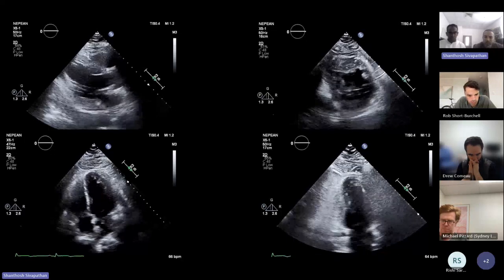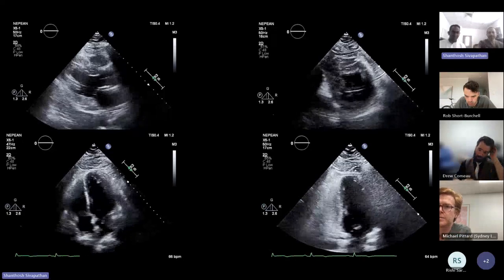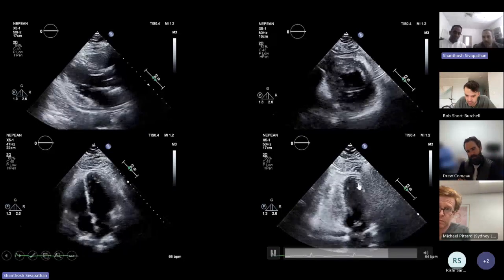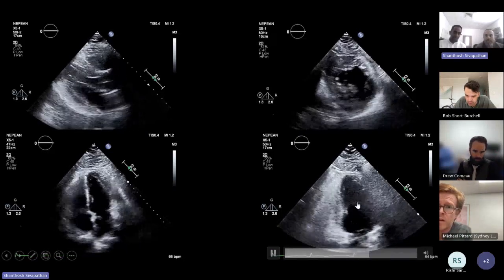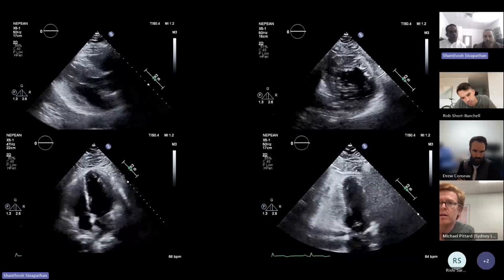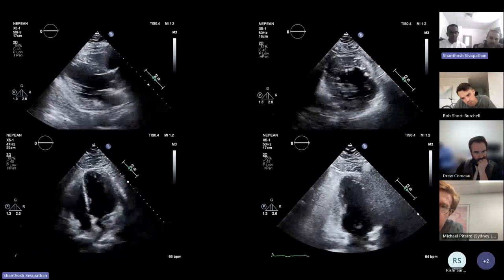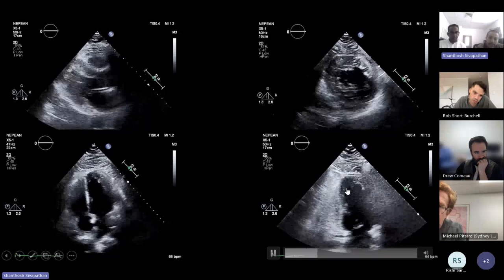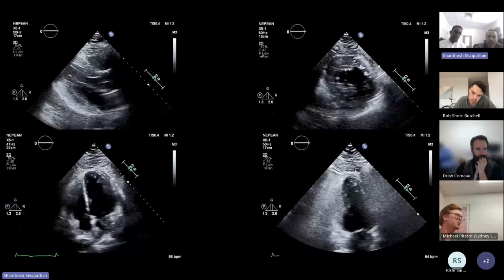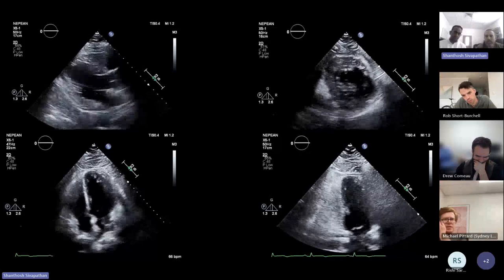And when you come around to the 2-chamber view, where you've got your anterior wall on the right-hand side of the sector, which is partially obscured by some artifact there, probably coming from lung, you can see that looks to be contracting well during end systole. It's come right in. Whereas the inferior wall on the opposite side of the sector is moving in but not thickening at all. It's getting pulled and tugged, and you can almost pick a point just coming around to that inferior side of the apex, where it looks like it transitions from thickening to not thickening, just pulling. It's like a hinge point almost. So this looks like this patient's got an inferior infarct with akinesis of those segments.